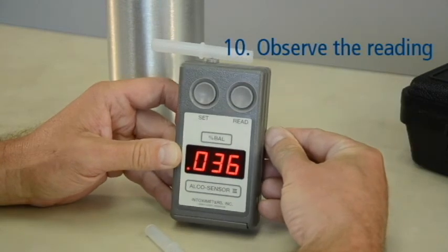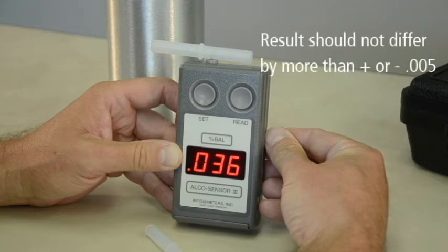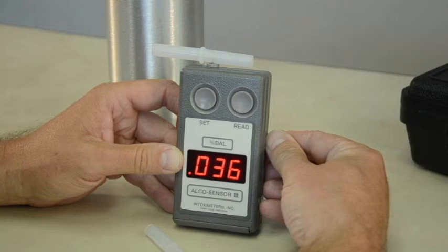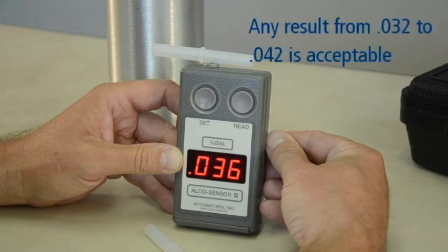Observe the reading until it becomes stable and bright. Remember, the results of your accuracy check must be within plus or minus .005 of the expected known value. From our earlier example of an expected value of .037, any result from .032 to .042 is acceptable.